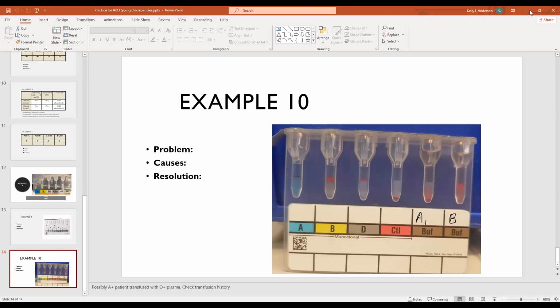And then as a side, this would be reagent A1 RBC. When I'm showing something, I like to show you what's going on in one thing and what's going on in the other thing, so you know the difference in what's happening. So this would be in a multiple myeloma patient that has extra proteins causing rouleau. And I cannot spell rouleau off the top of my head. I'm so sorry. There's too many vowels.